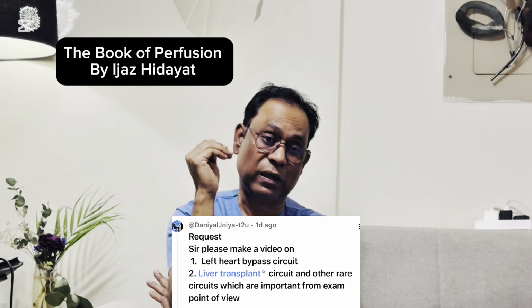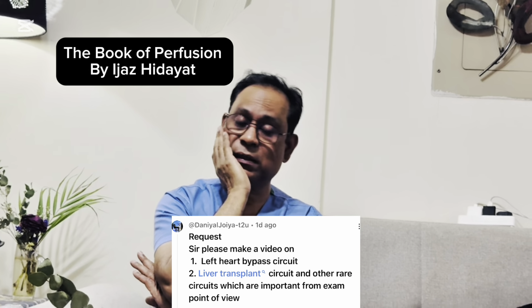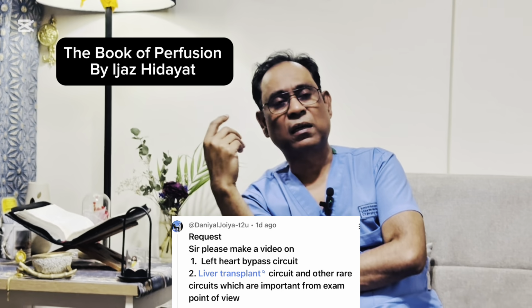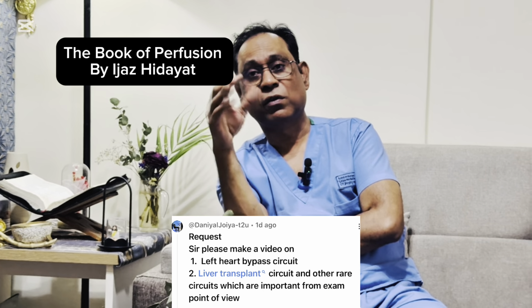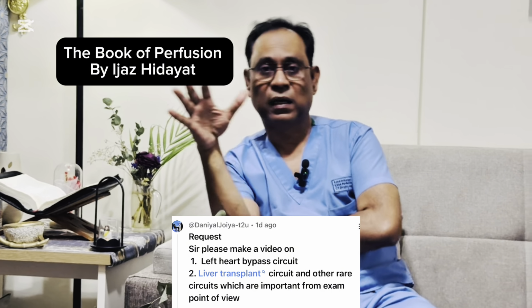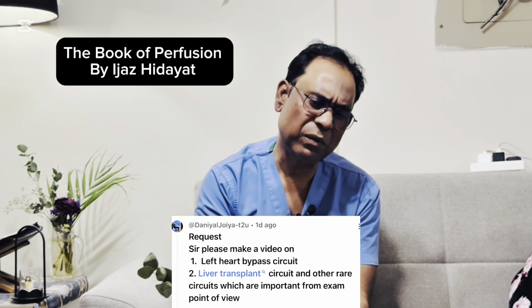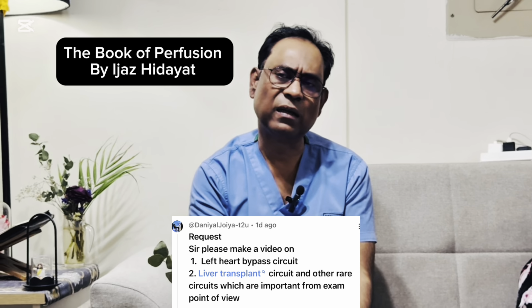The target is to perfuse the lower limb of the body while the surgeon is working on the abdominal aorta or thoracic aorta. We can create a left heart bypass not with the routine heart lung machine, but even with a single centrifugal pump, or sometimes additionally with a cell saver. So no need to go with a complete heart lung machine. Nowadays people are using a small centrifugal pump with the cell saver, and they do left heart bypass surgeries easily and safely.